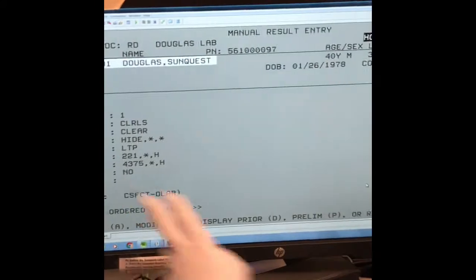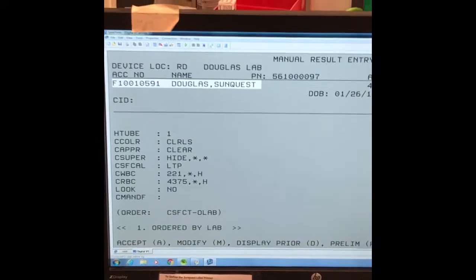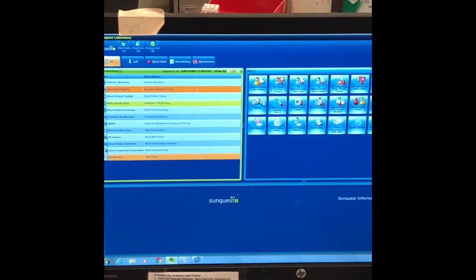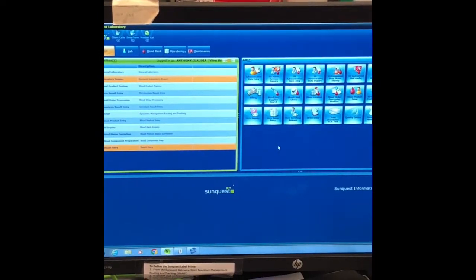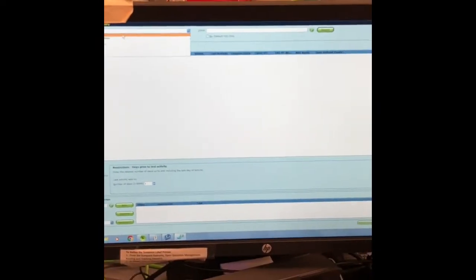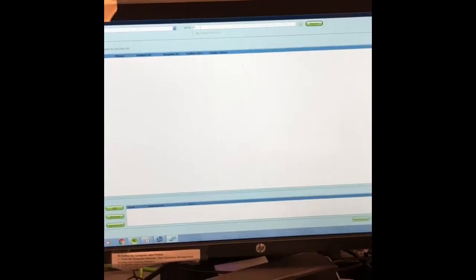And you see your manual diff is pending. So go ahead and accept it, and let's see how it looks in GUI, because I'm a double checker person. I go back and forth, and it's in your brain already.